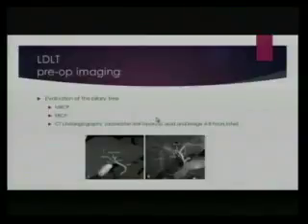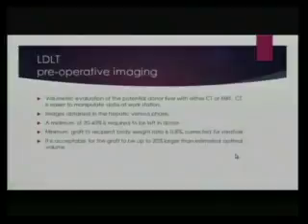Dr. Sangster, have you ever used this? I don't think we ever used it here. But you image 6 to 8 hours later. This is an example of that. Yeah.